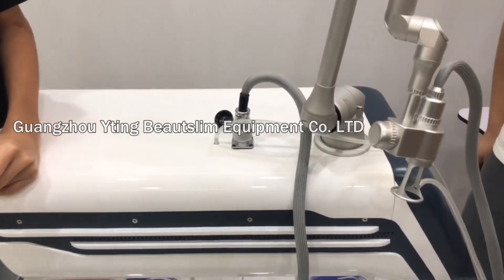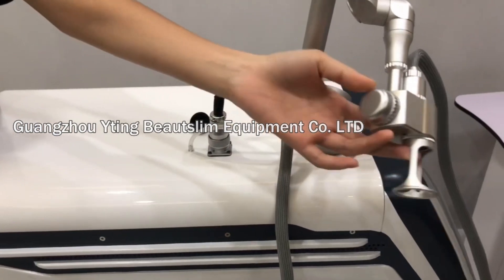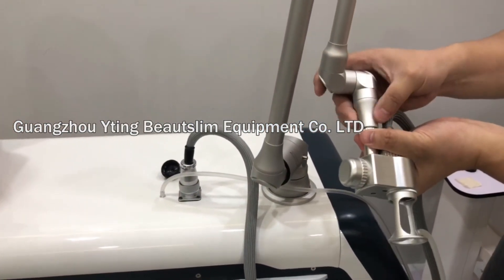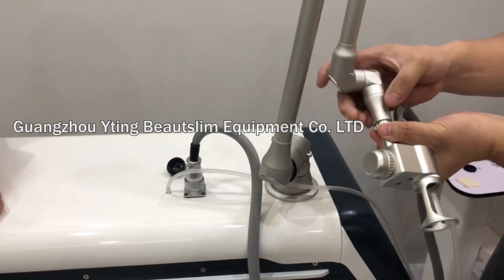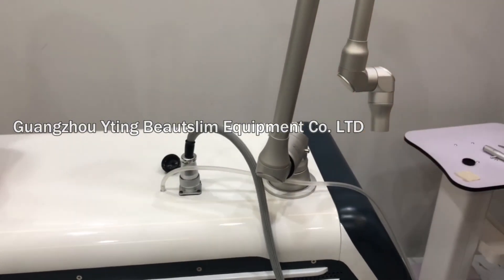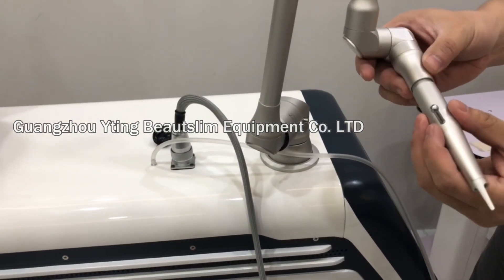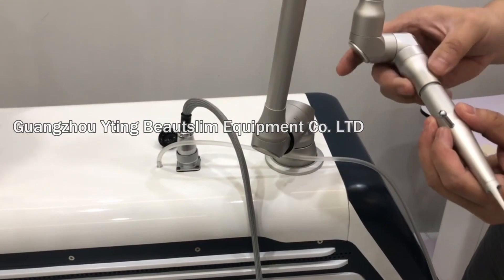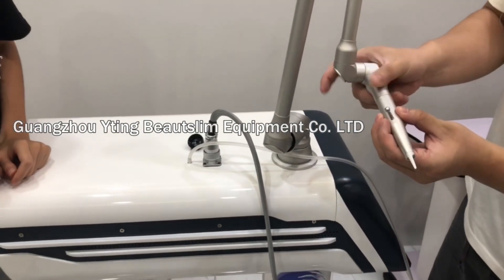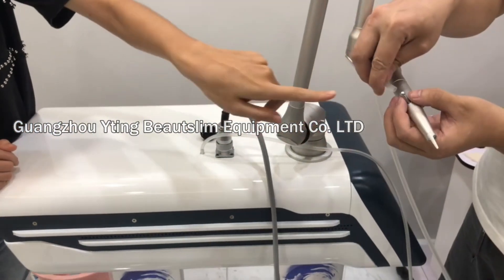If you want to change the hair, you can rotate it and change. Rotate it the same way. Also, connect this tube here.